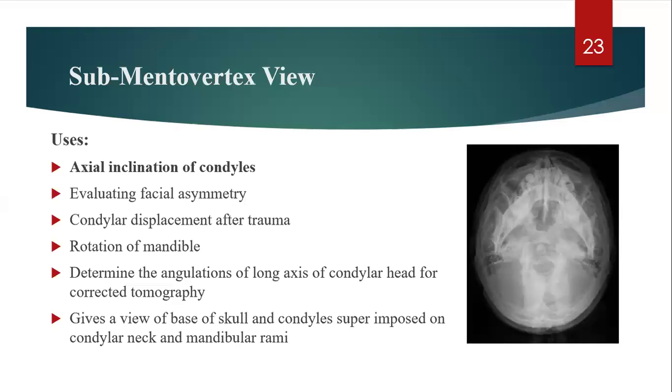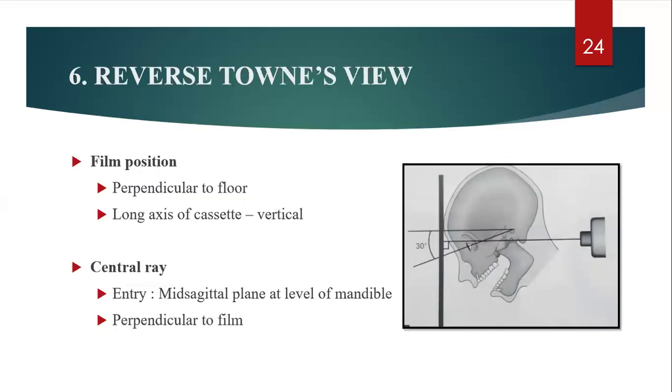The use of the submentovertex view is to identify the axial inclination of the condylar head. Also for evaluating facial asymmetry, rotation of the mandible, and displacement of the condyle in case of trauma.